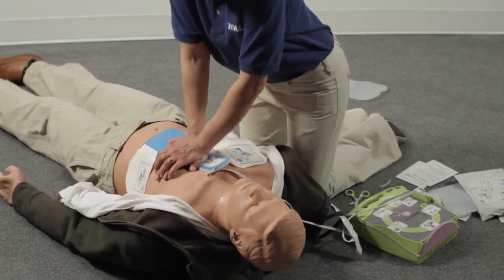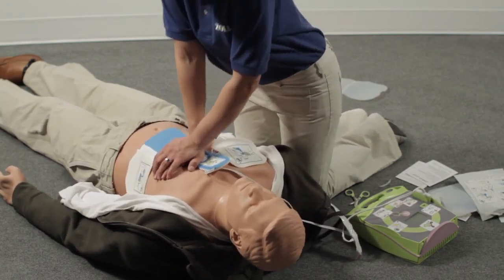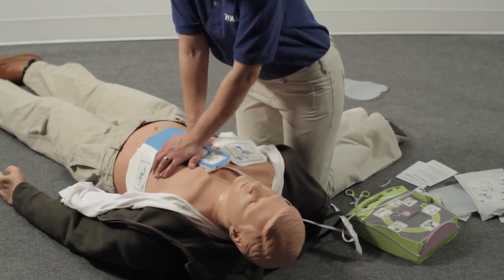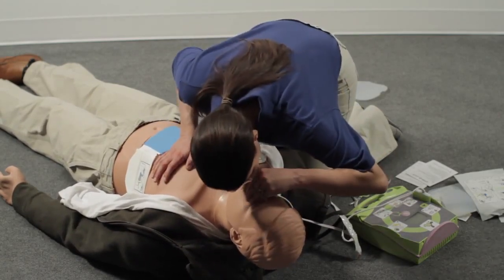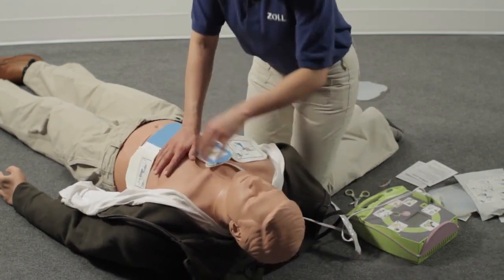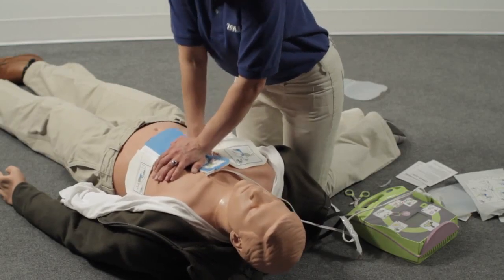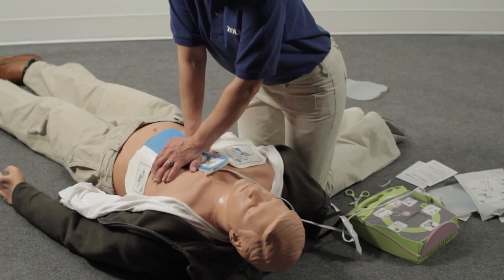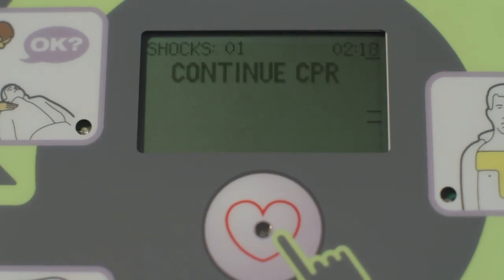Rescuers who lack the training or confidence to perform rescue breathing should perform continuous compressions without stopping. Compress the chest hard and fast 30 times, then give 2 breaths. After 2 minutes, you will have completed about 5 full cycles of 30 compressions and 2 breaths. If you don't start CPR right after being told to do so, you will be prompted every 10 seconds until you do start. And if you stop for longer than 10 seconds, the AED Plus will tell you to continue CPR every 10 seconds until you resume.